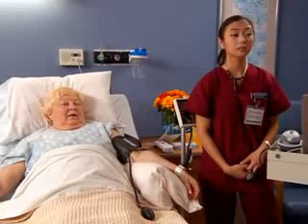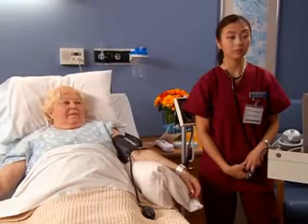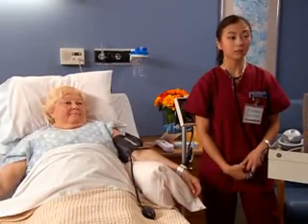Okay. All done, Mrs. Hodge. Your blood pressure is 112/64. Great. Now, if you're suspicious of a reading, wait at least 1 minute before you try it again. Remember, if you want to recheck the pressure reading, do not reinflate the cuff once the air is being released. Wait 1 minute and repeat the measurement.